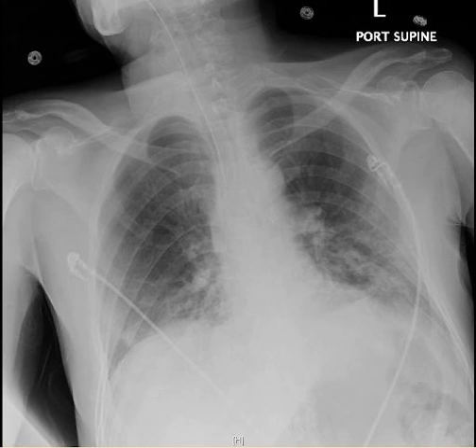What you see with ultrasound is that as patients get more severe lung disease, you get more obvious findings on ultrasound. If they have ground glass opacities on X-ray, that oftentimes correlates with people having B lines on their ultrasound, and those B lines look almost like little shafts of light that go through your ultrasound.